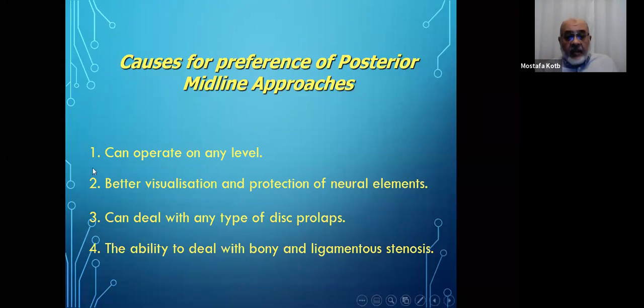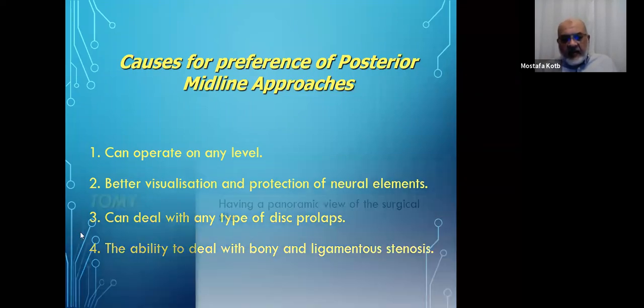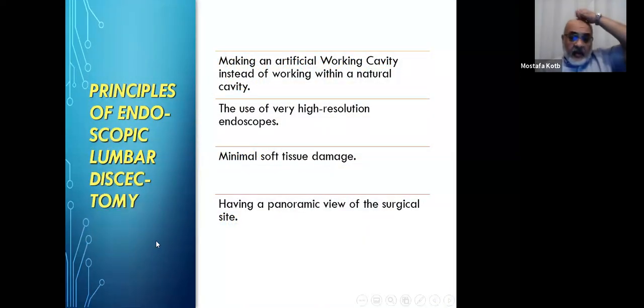By that time, in 1977, there was the simultaneous introduction in the US and France of two endoscopic systems. And I thought that they met the criteria that I thought would be better for operating on the lumbar disc using the endoscope.